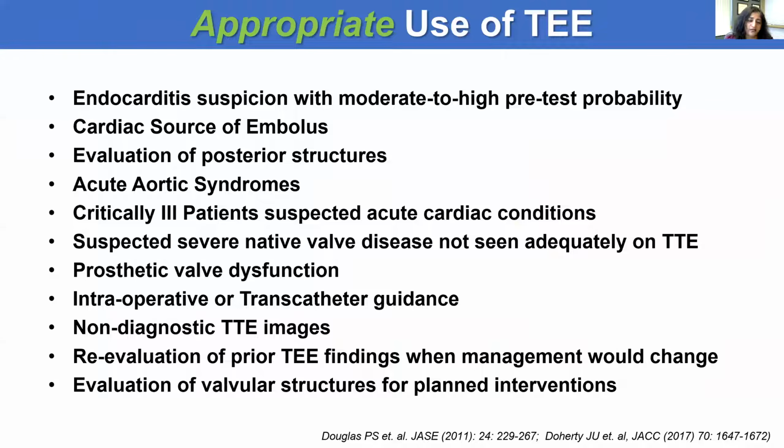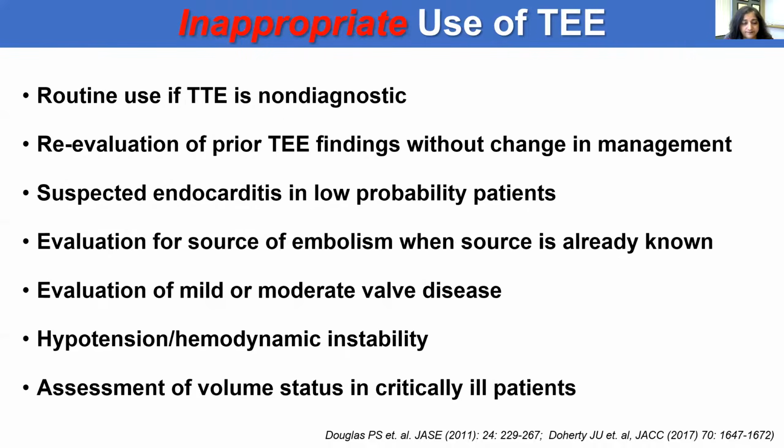The appropriate use of TEE is something that you can be tested on in the boards. Particularly, they'd like you to know that TEE is indicated in endocarditis suspicion when you have a moderate to high pretest probability. It is indicated in acute aortic syndromes. And any time when you have non-diagnostic TTE images and TEE findings might change clinical management.